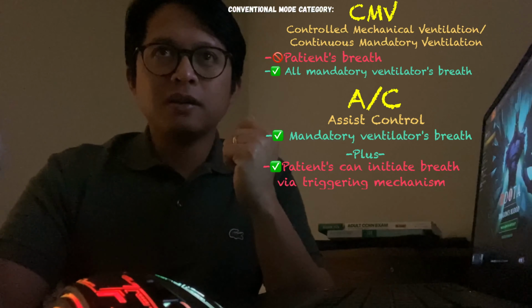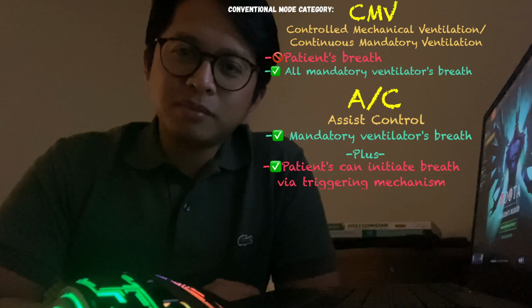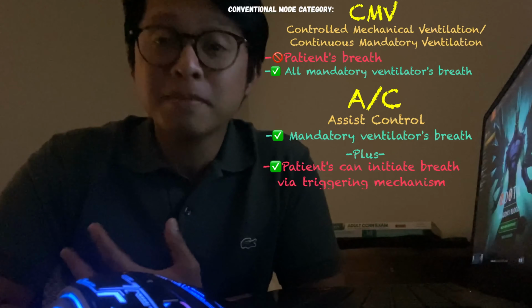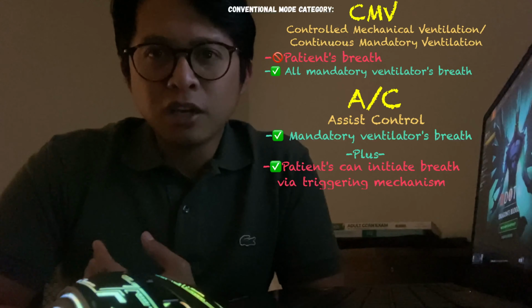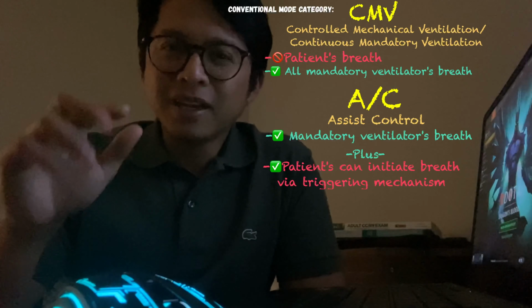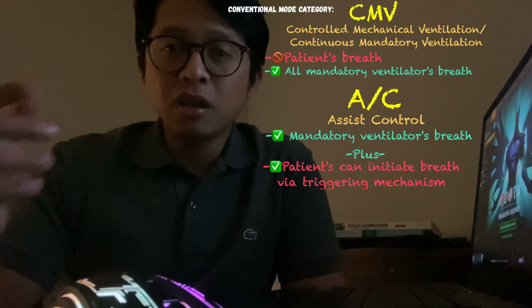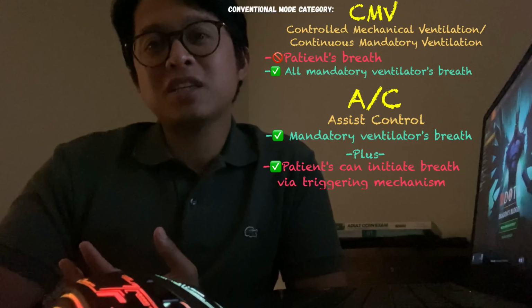Okay, the AC mode. As I've said, in AC mode, the patient is allowed to initiate a breath. Actually, most of the ventilator breaths are time cycled or time triggered. For example, you set the RR to 10. The breath will be automatically time cycled because the ventilator will give a breath every 6 seconds. Why? Because 60 seconds divided by 10 is equal to 6 seconds.